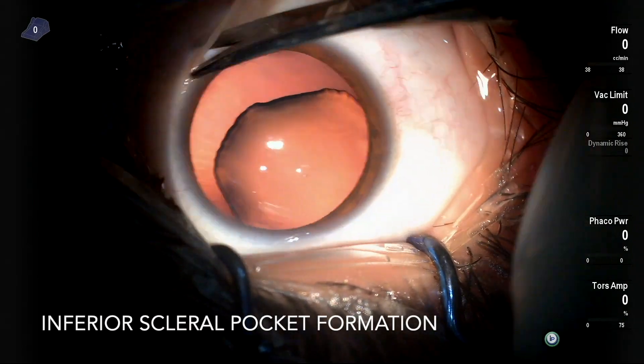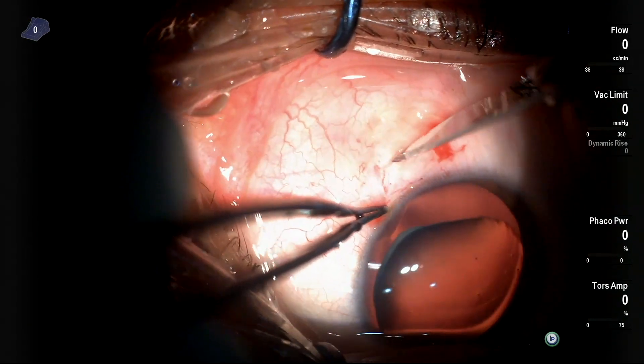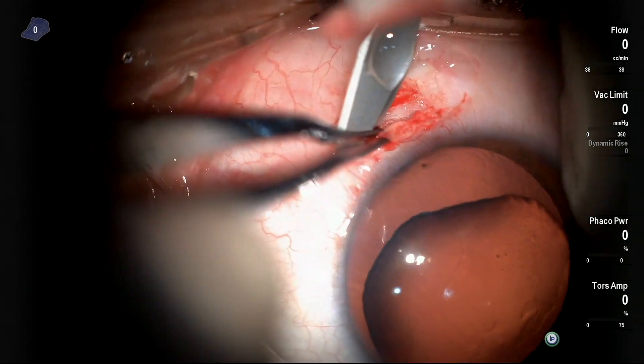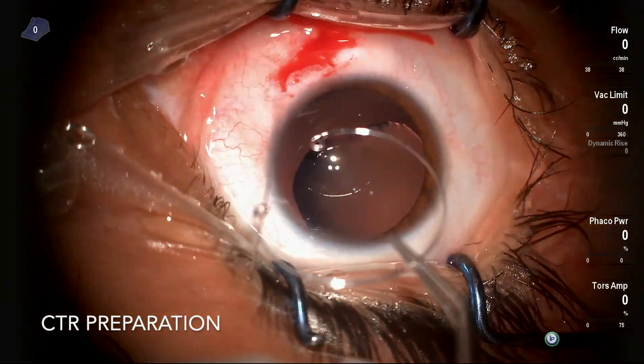I started first by opening the conjunctiva infero-nasally and doing a scleral pocket or scleral flap using a 15 crescent blade.